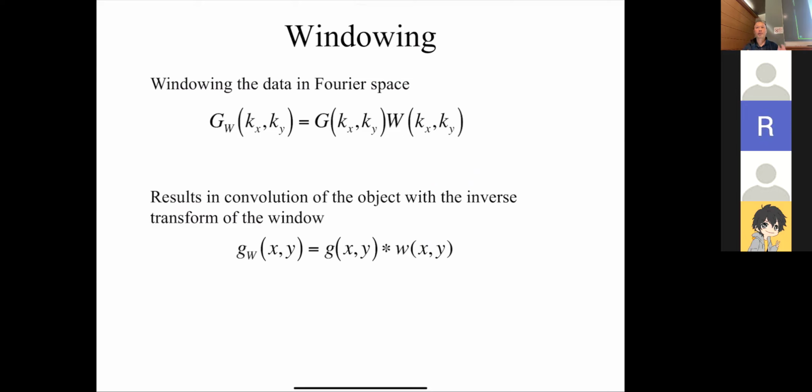Windowing is saying, we've talked about the sampling, what's the delta K? Now we need to talk about how far out do I go in K space. That's going to determine my window width. Windowing looks like this. This is the K space I have, for example a rect function that goes out to plus or minus infinity. I don't really want to go out to infinity because that's going to take forever, so I only look at the data within some K space window.